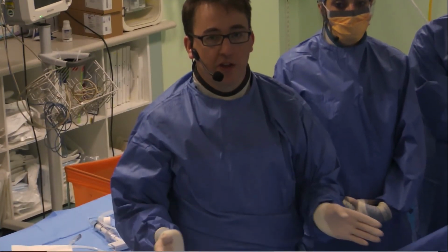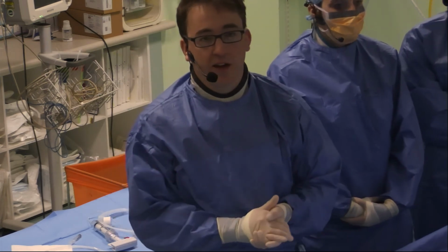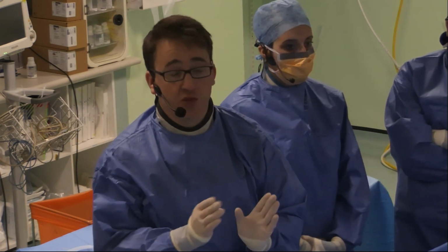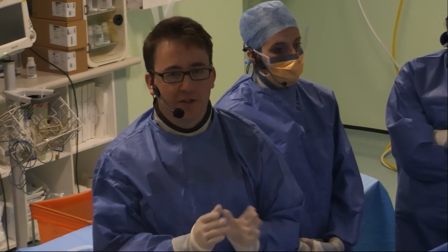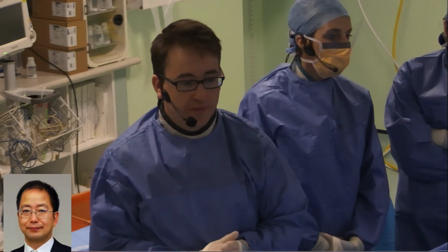Don't worry about pulling it back too fast or too slow. It's just a normal rate which you'd pull it back over 15 or 20 seconds, and then we get the answer. In this case, I think the whole pullback after we'd had the initial run-in phase was around 25 seconds. So that's fairly typical. That's a long LAD we were assessing there. I don't know if you just want to communicate that, Hitoshi, to the audience.